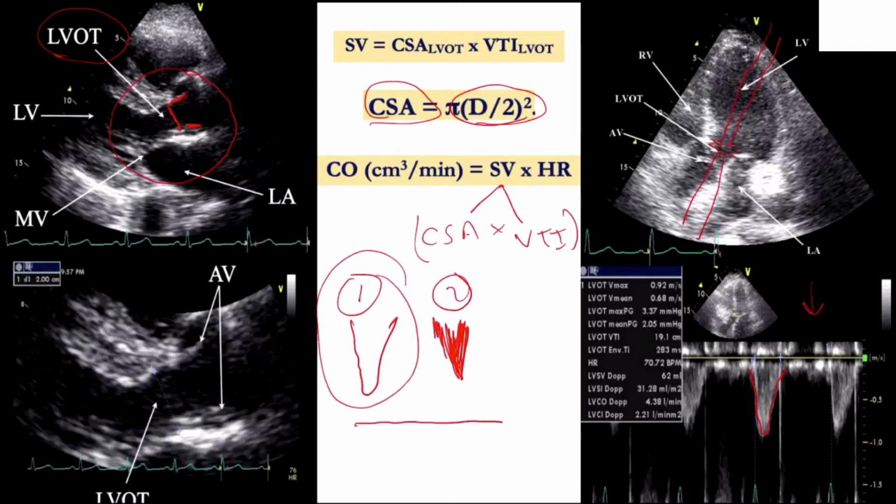We talked about this very early in our lectures, that if you have a red blood cell going through a vessel, you want all of the red blood cells traveling at a similar velocity. As we go along this path here on the bottom of the screen, that's time, on the x-axis. So you're measuring instantaneous Doppler velocity of a red blood cell at time 1, 2, 3, 4, okay? And if you have all of the cells traveling at the exact same speed, you're going to have a very dense mark at that area.